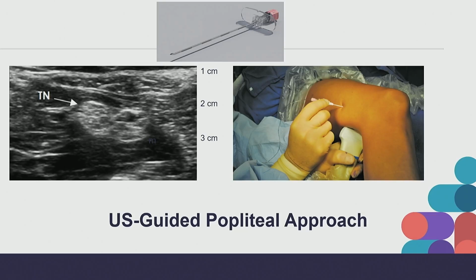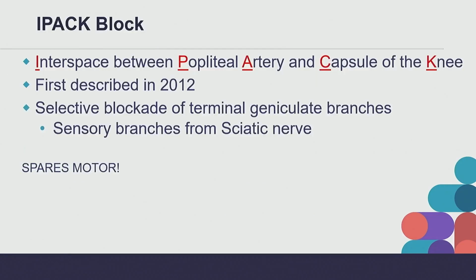And so I'll use these marks on the needle to measure. If this is 3 centimeters from the surface of the skin based on the ultrasound, and this is my target, then I'm going to measure 3 centimeters up with these markings. And then X marks the spot, and then you can come in very straight across the screen to really visualize your needle. And that tends to help quite a bit with finding and optimizing the anisotropy of your needle as you do this block.